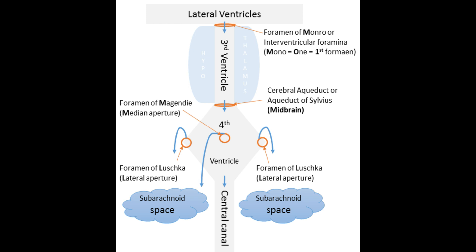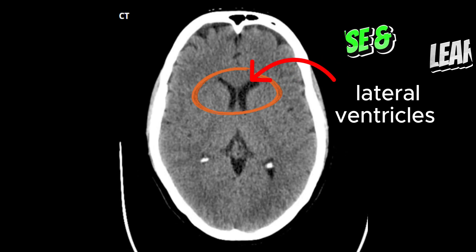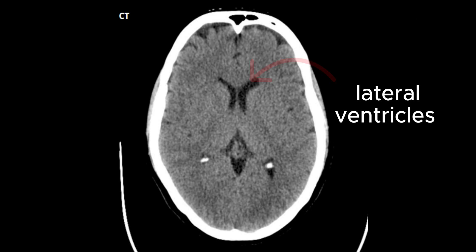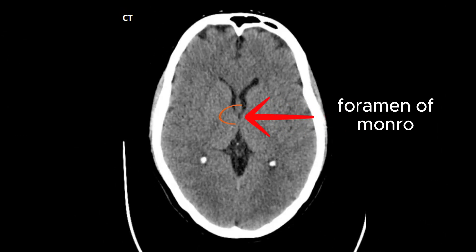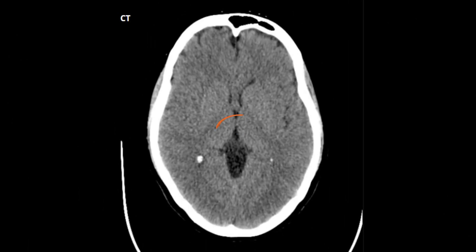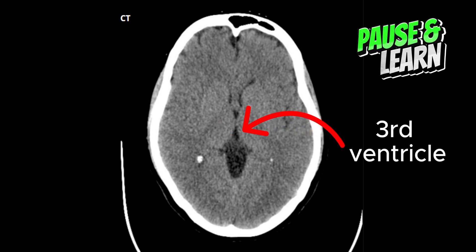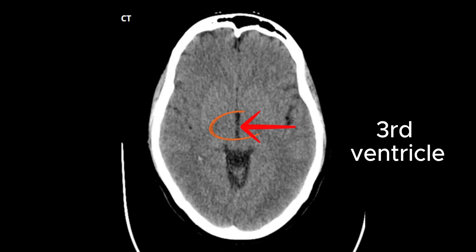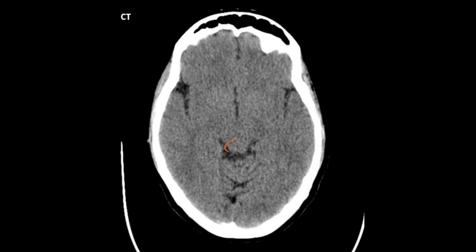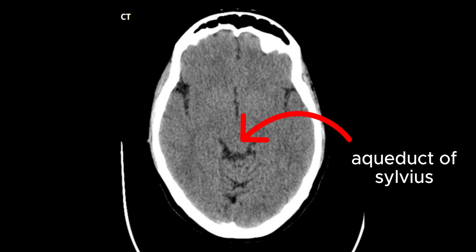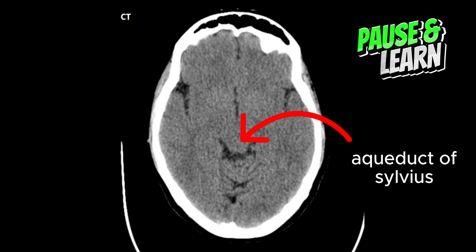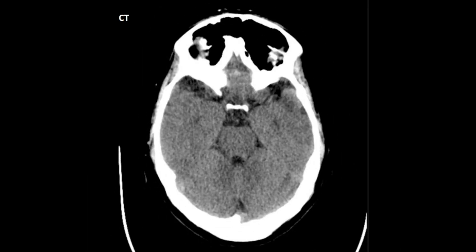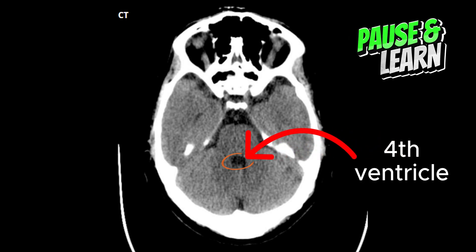Because CSF is a fluid, the ventricles appear dark on a CT film. You can see both lateral ventricles joining with the foramen of Monro as we scroll down, communicating with this slit-like structure which is the third ventricle. The third ventricle communicates with the fourth ventricle via the aqueduct of Sylvius. Here you can see the aqueduct of Sylvius joining the fourth ventricle, which appears a bit triangular shaped.